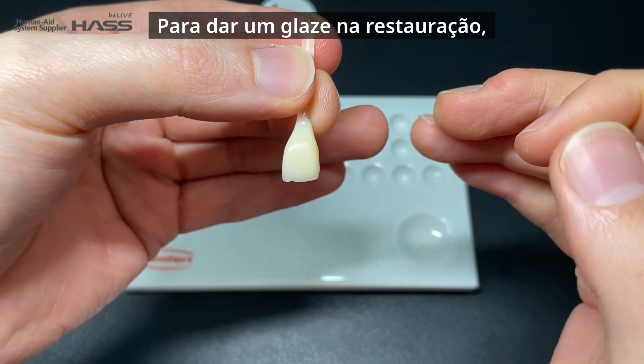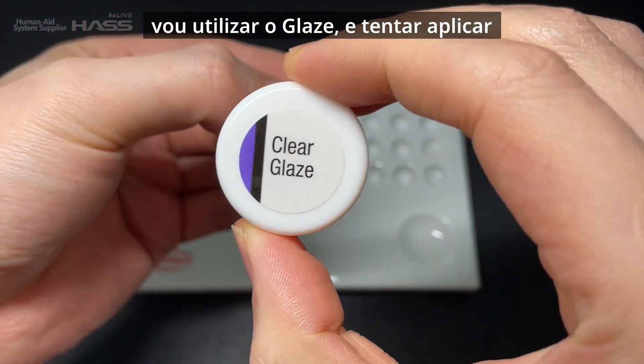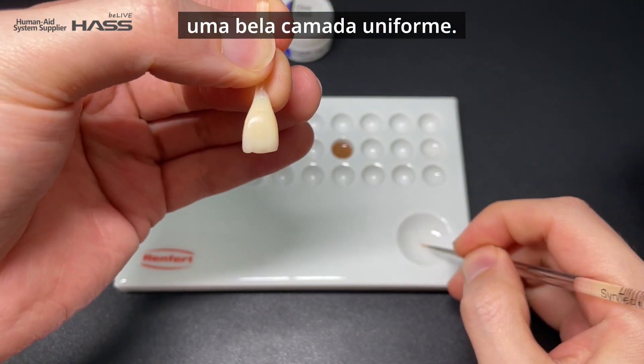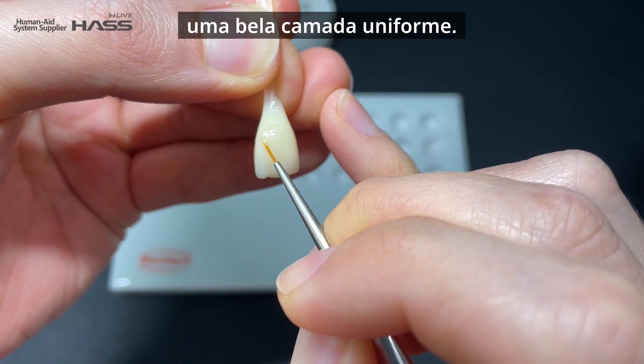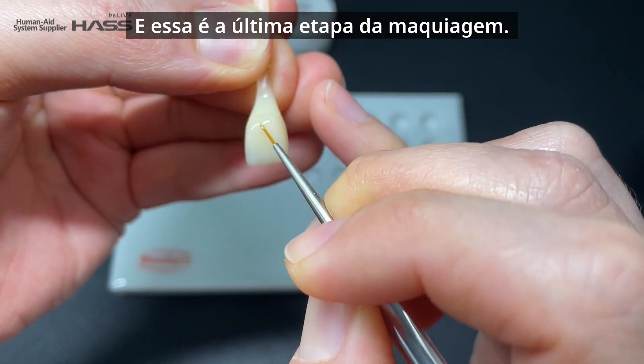To glaze the restoration, I'm going to use clear glaze and try to apply an even and nice coat. This will be the last step of the fabrication.